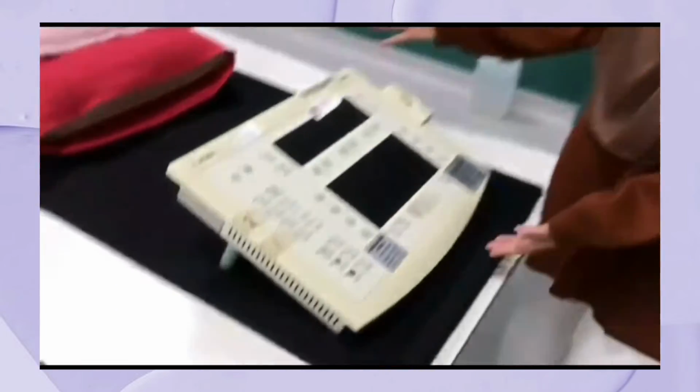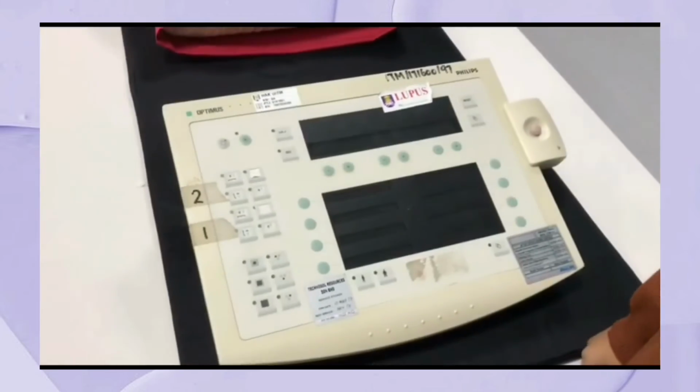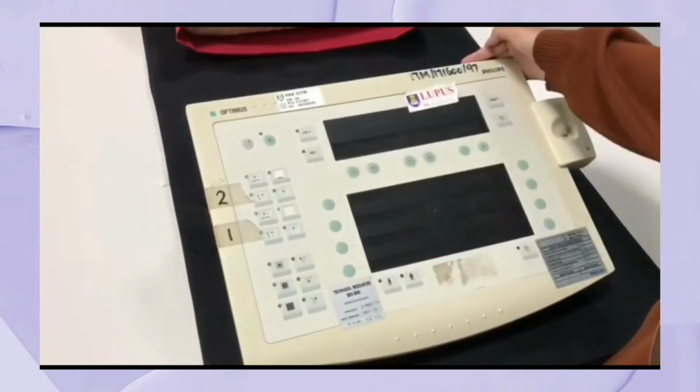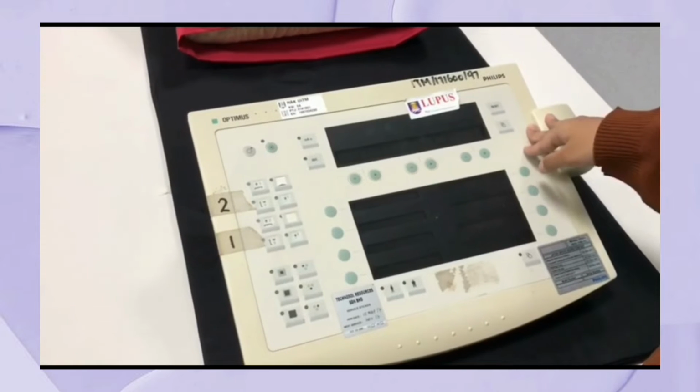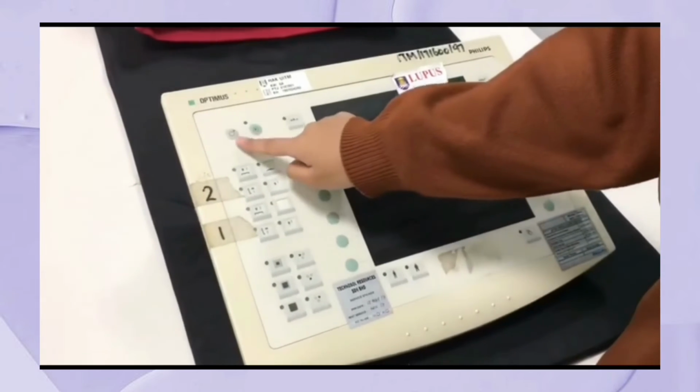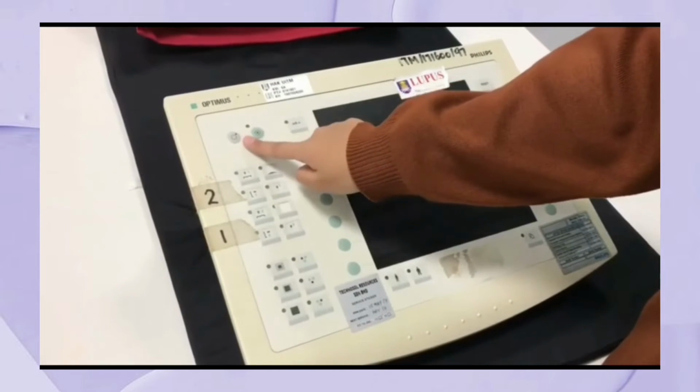Okay, so here we have our control panel, and this button is used to turn on our control panel, and then we can also control our mAs and kVp. Okay, so this button is used to turn off.